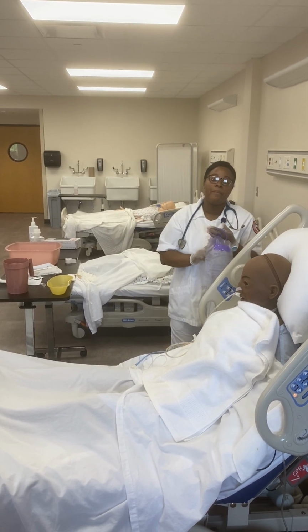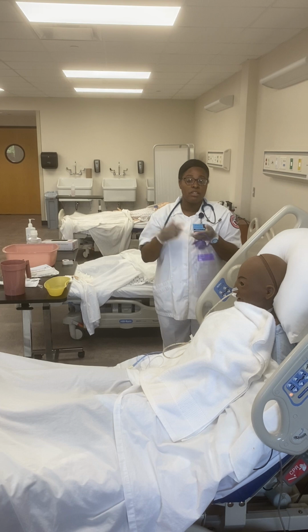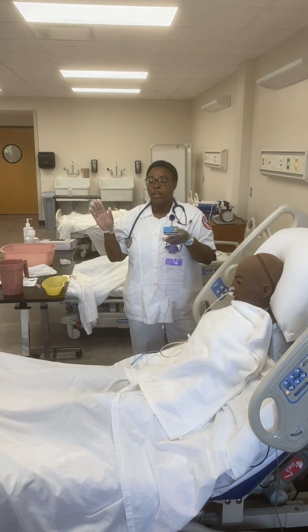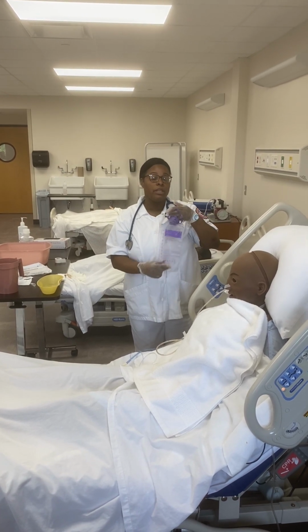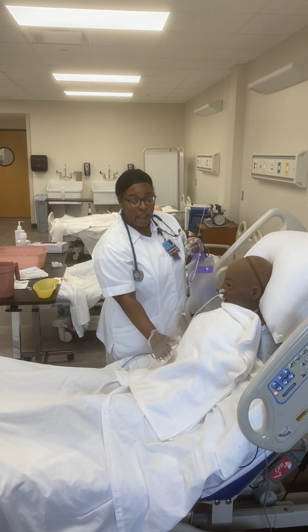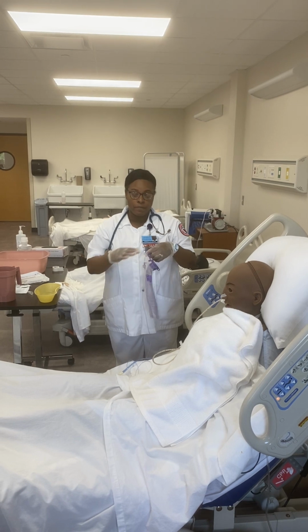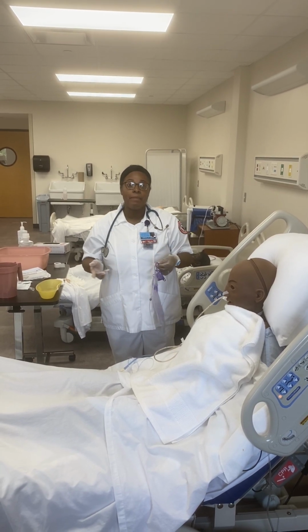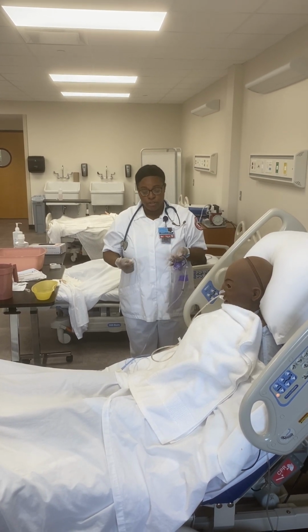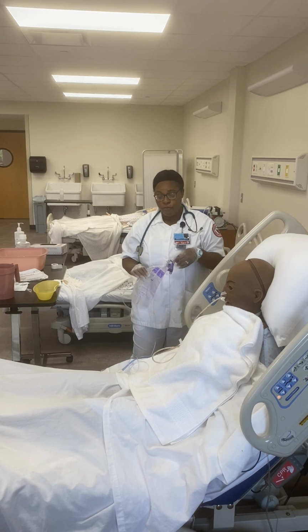You need to flush the tube every 4 to 6 hours, and check the residual every 4 to 6 hours, and also flush with 30 mils of water before and after each medication. You need to change the bag set and tubing every 24 hours. You need to cleanse the abdominal site daily if it's abdominal site feeding. After that, I will document the procedure, document the amount of the gastric residuals, document the patient's tolerance to the procedure, and remove my gloves for hand hygiene.